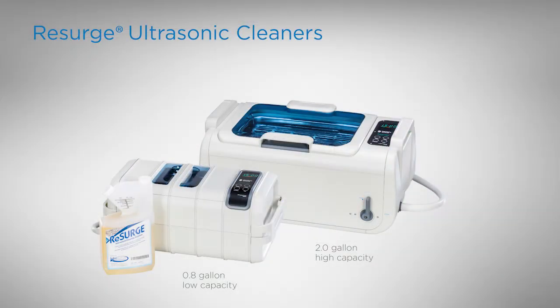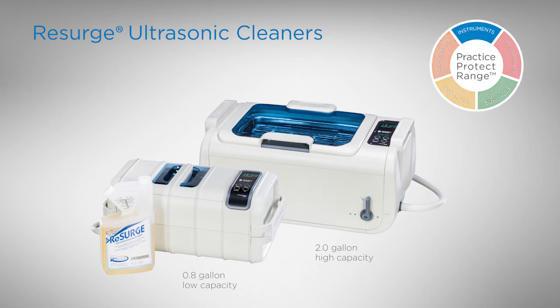Resurge ultrasonic cleaners — delivering better, safer, faster instrument reprocessing.